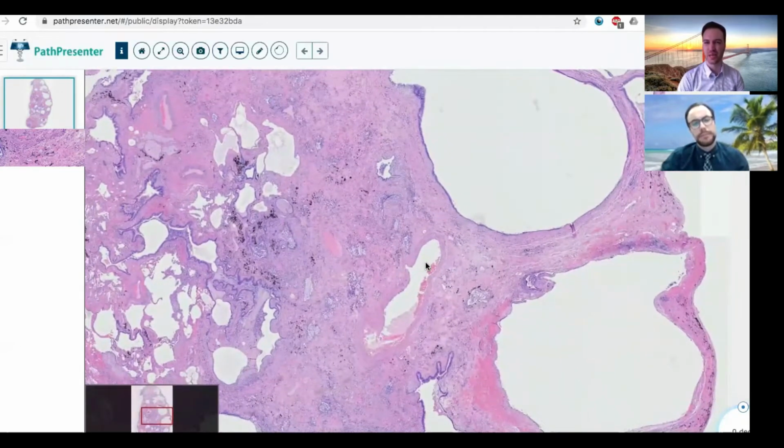So I read that NSIP is a bit of a misnomer, and that really it looks quite more homogeneous. So this homogeneous thickening can be similar to infiltrate in the septa or simply collagen. Yeah, so the NSIP, you're right, it does have a much more monotonous look to it. It's very homogeneous. The septa are uniformly expanded by a fibrotic process, and that would be a classic case for an NSIP. Whereas this is very heterogeneous, both temporally and spatially, as you pointed out.